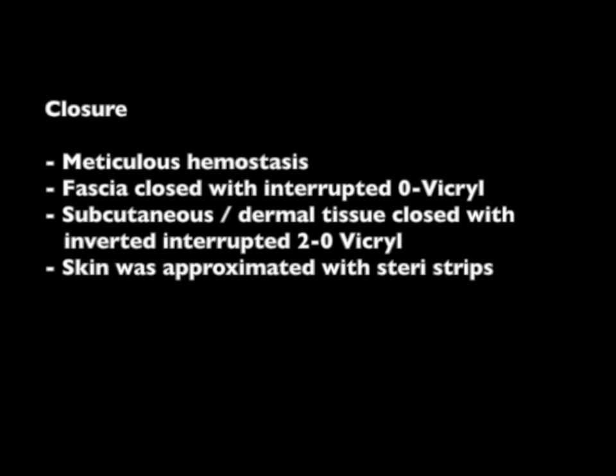Next, a multi-layer closure is accomplished. Interrupted Vicryl suture is utilized to close the fascia. Inverted interrupted 2-0 Vicryl sutures are utilized to close the subcutaneous and dermal layers. Steri-Strips and Mastisol are used to approximate the skin.